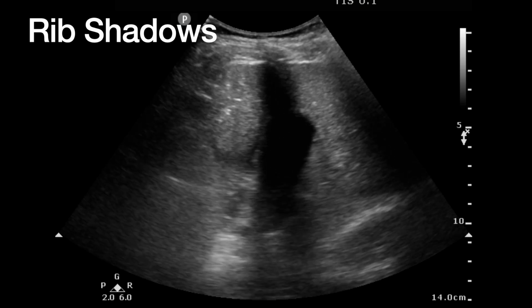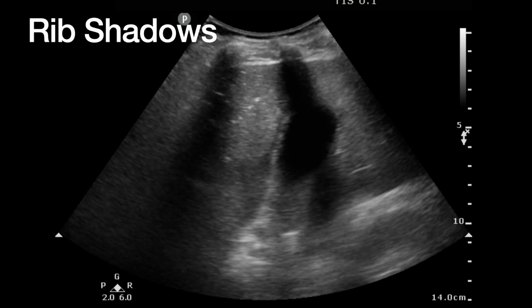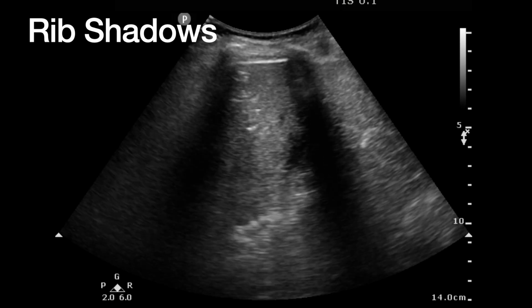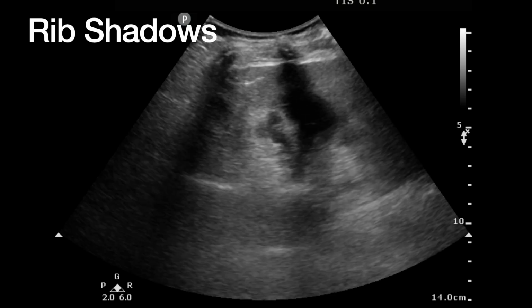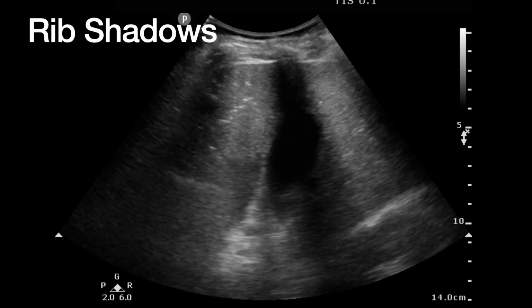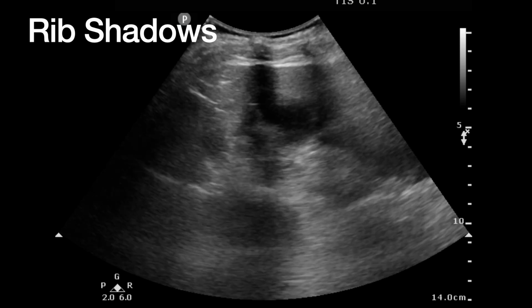And so the thing to do here is, if you can't see what you need to, move, right? If you're in a crowd watching someone on a stage, or at a concert and someone tall is in front of you, how do you see the person on the stage? You move, right? You look around them. It's the same thing with the ultrasound here. Either you move the probe, go down and look up, go up and look down, twist to get between the ribs, things like that, or you have the patient move their gallbladder, right?